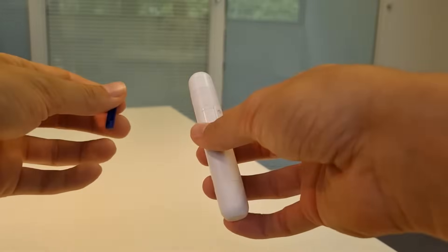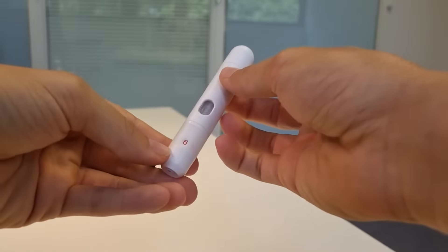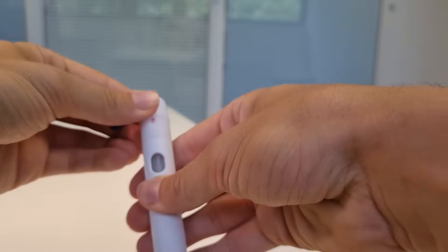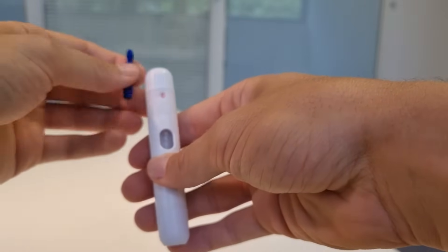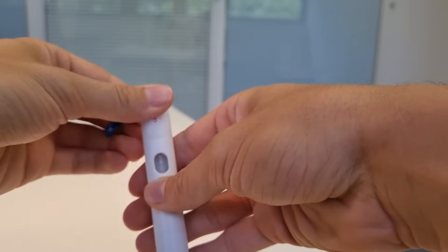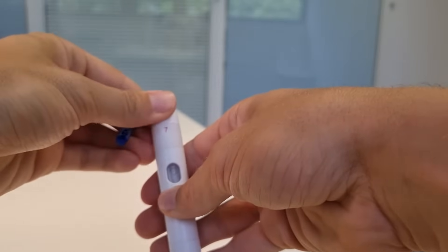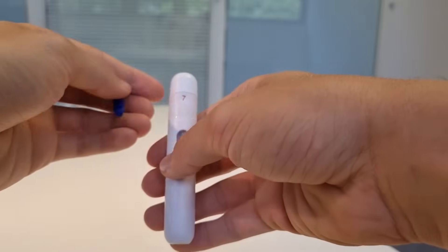To take a blood sample you're going to need your lancing device and a lancet. This lancing device has nine different levels, which is the depth of how far the needle is going to go into your finger. I suggest you start off with a light level and if it doesn't draw enough blood then go to a higher level. I've used this before so I'm going to start on seven.